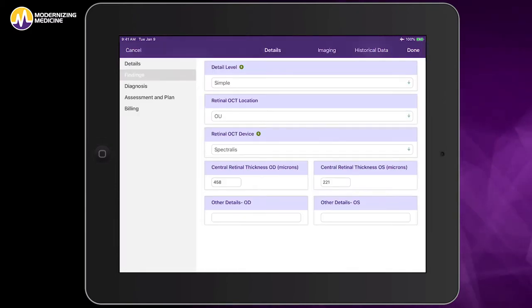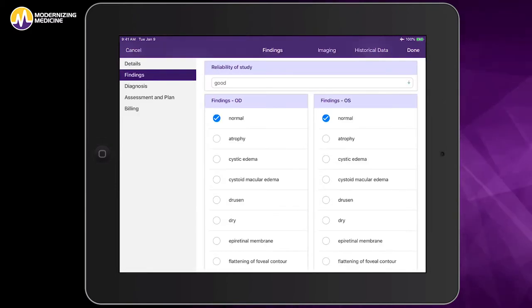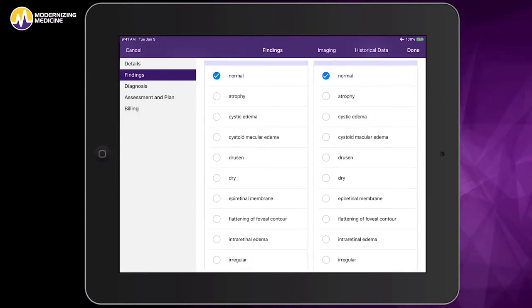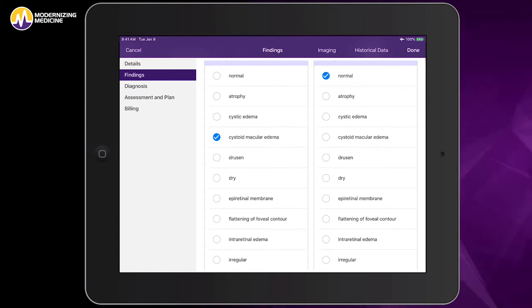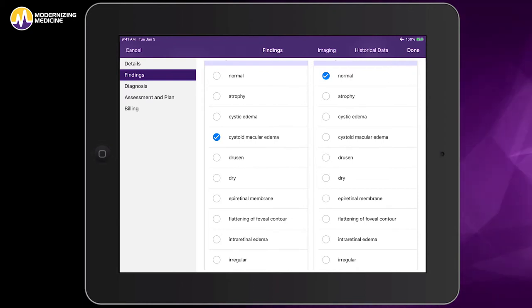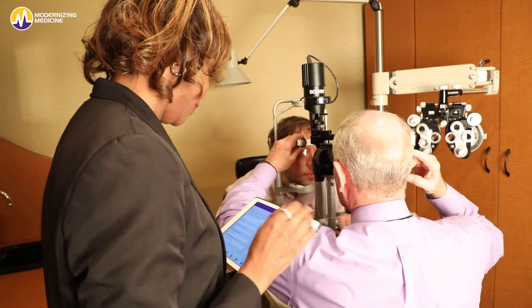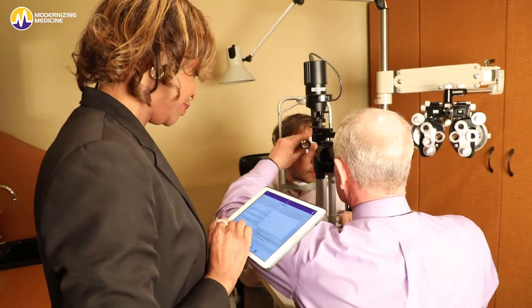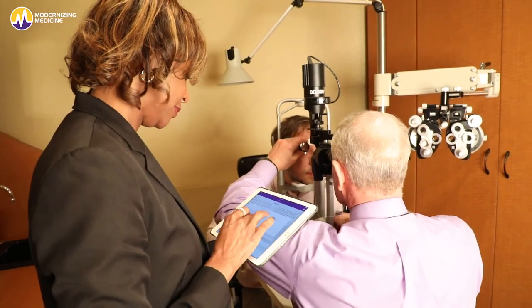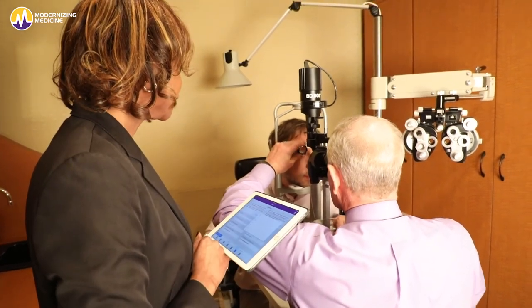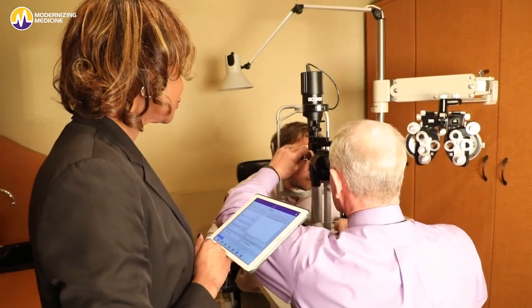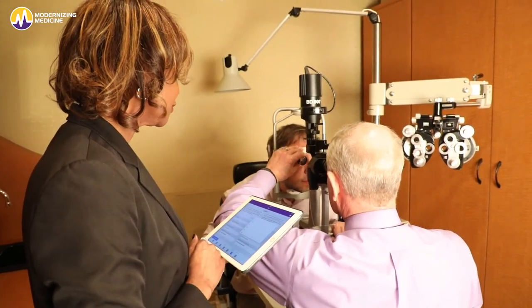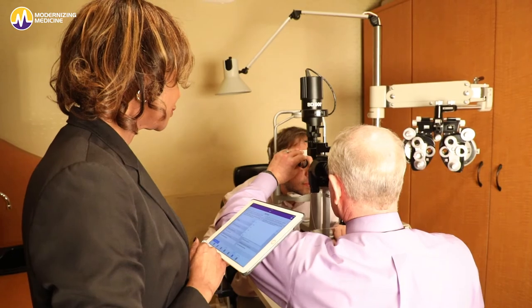To wrap up, I can quickly go back and document my findings, showing that there is edema in the right eye. Interested in seeing more? Schedule a demo session today and see how our image management system can help your retina practice.